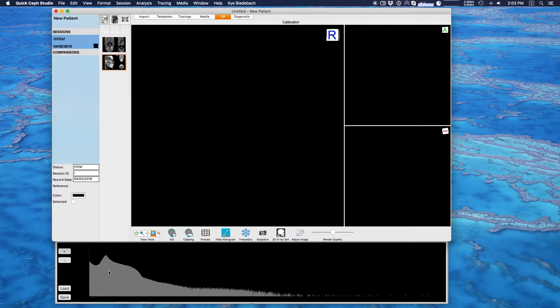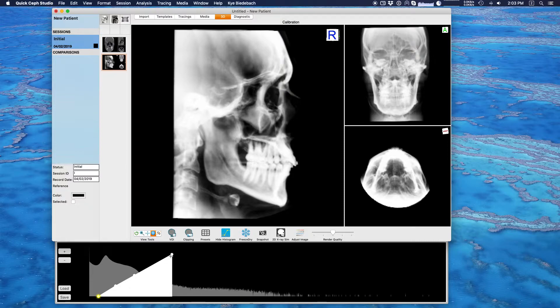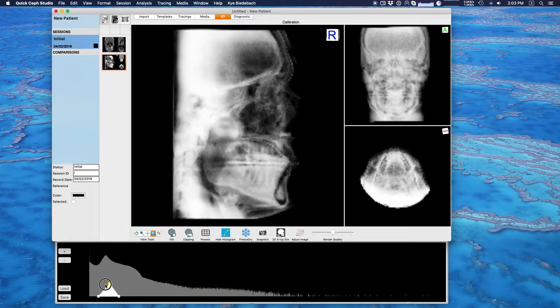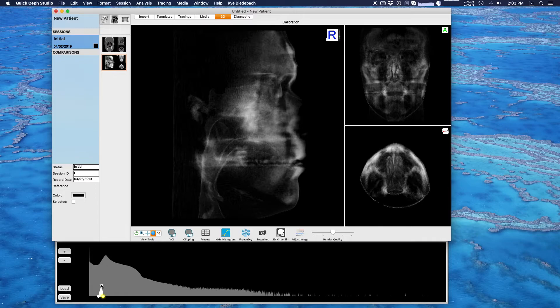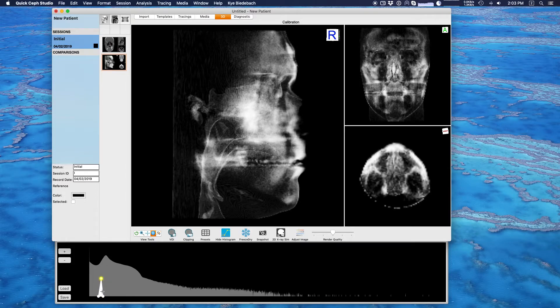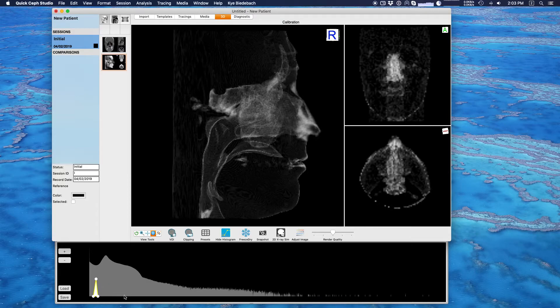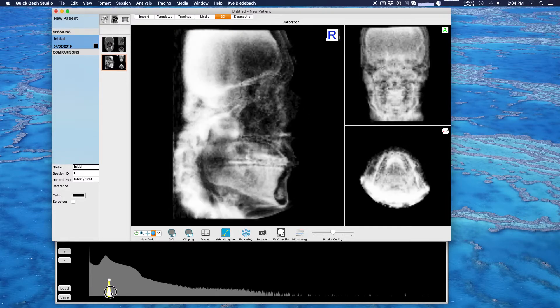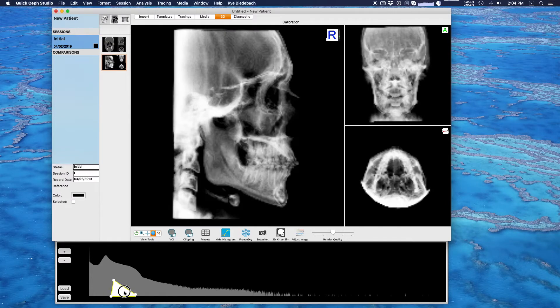The brightness goes up — very dark at the bottom and brighter as you go up. So let me explain this by adding a little triangle. I hit the plus button to add a new transfer box. These represent what you see of your data. Whatever area this white triangle covers is what we're going to see. If I move this to the left, that's very lightly dense tissue, and as I move to the right I'm seeing more dense tissue, starting to get to bone.